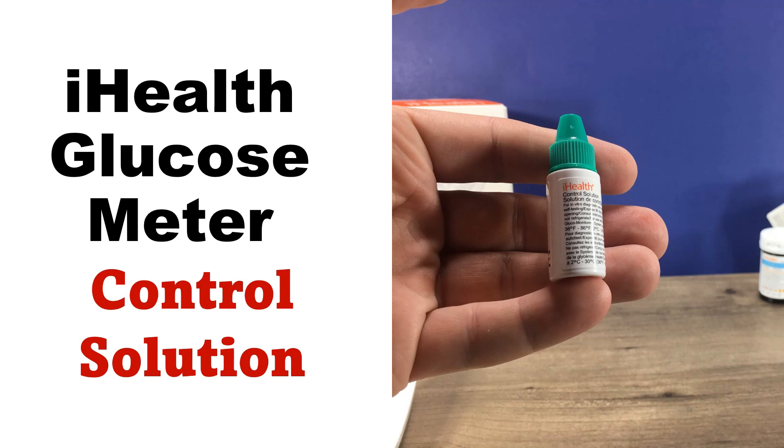Hi, this is Josh, pharmacist with Learn Blood Sugar Testing. I'm going to take a quick look at using the control solution for the iHealth glucose meter.